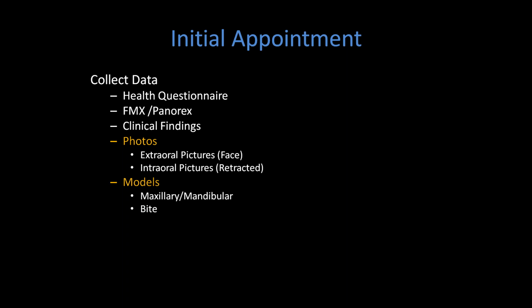In addition to that, we will capture maxillary and mandibular models, and today we can do that with virtual intraoral scanners and capture the bite. And then most importantly, if you're going to provide this type of treatment, you need to implement CBCT technology. So we'll scan the area of importance, or if it's a full mouth reconstruction, obviously we'll scan the whole mouth.